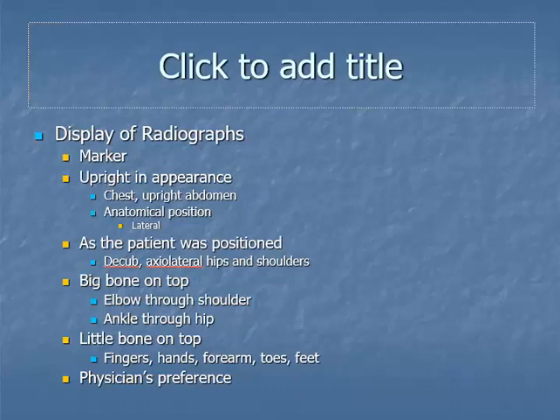So on our display of radiographs, some of your departments are very specific on your marker placement and orientation. Make sure you follow those protocols.